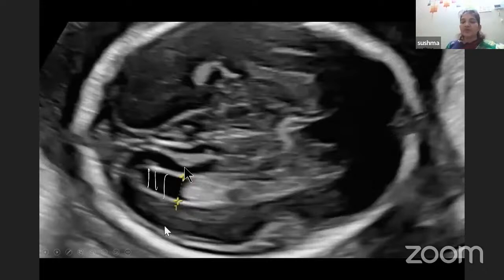And why do we choose only this level? Because at this point, the ventricular diameter is maximum. And this is called the atrium of the lateral ventricle. This is the reason we have to take the measurement at the level of this dimple here, the indentation that we can see here, the parieto-occipital sulcus. That is the point where we measure ventricular diameter.